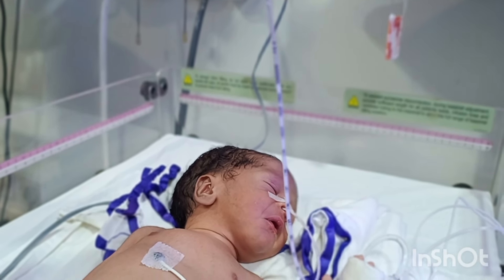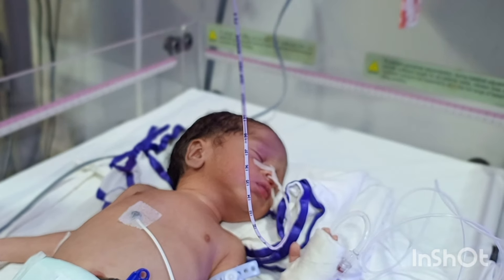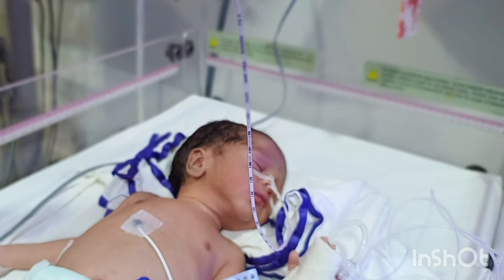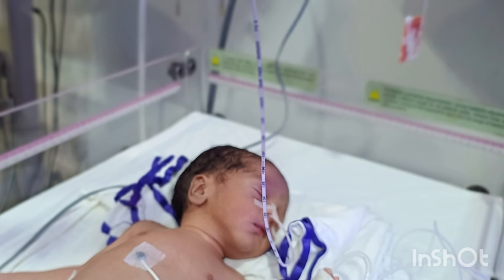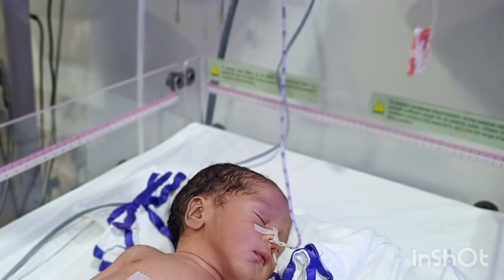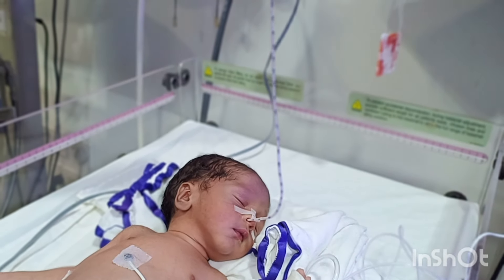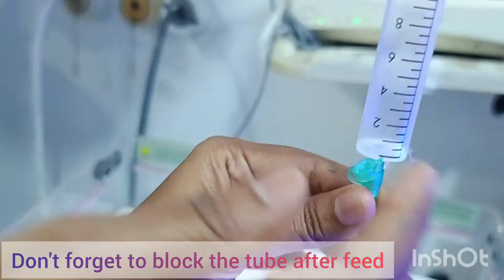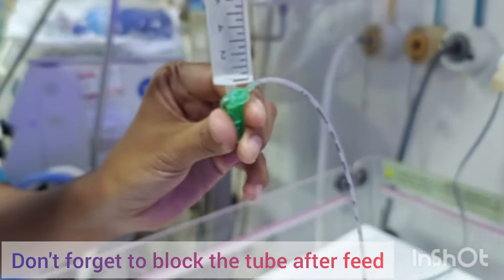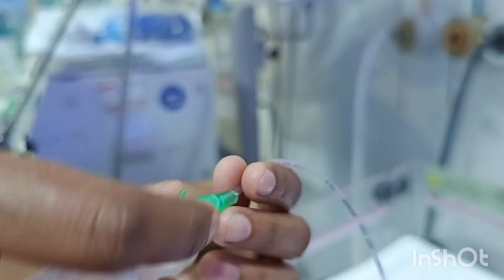The last drop of milk is going inside the baby through the tube, and the tube is getting completely empty. Once the tube is completely empty, we will block the tube. If you do not block the tube, the milk from the stomach may flow back out. Once you are completely sure the tube is empty with no milk inside, we detach the syringe and block the NG tube again, keeping it in position. Here we are just blocking the end of the tube.